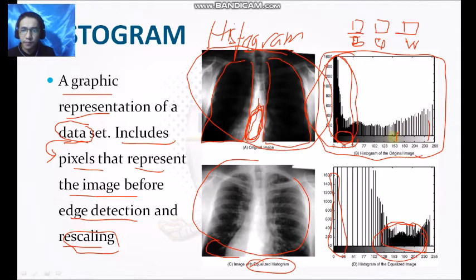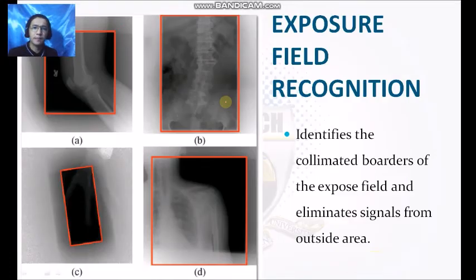Then what is the representation, and then the amount, how many of them have this. So for example, 1,600 of them contain this one. Approximately 200 pixels have this type of color or this type of shade. Okay, so that's basically the histogram.